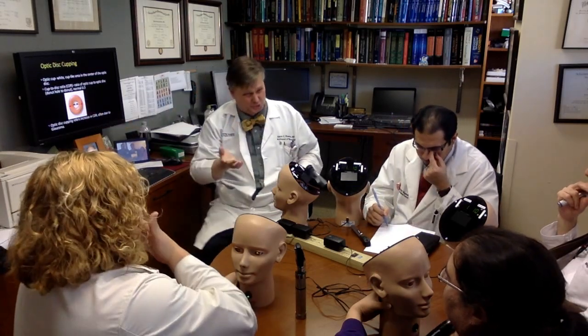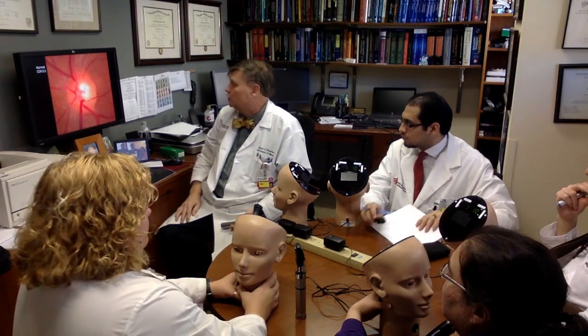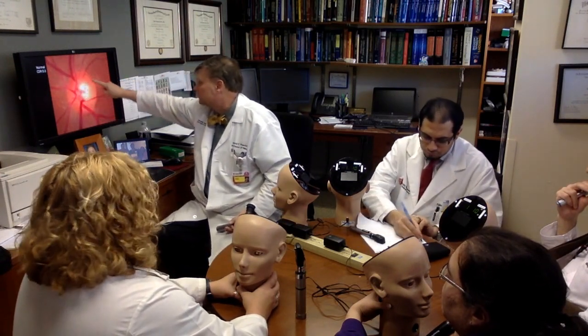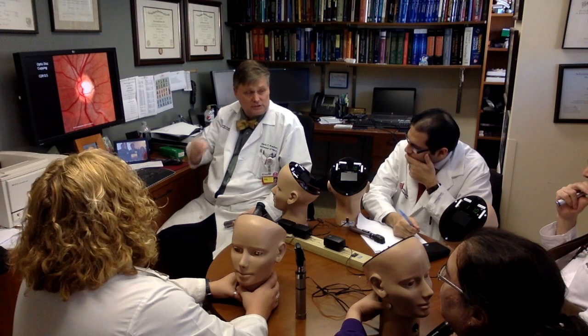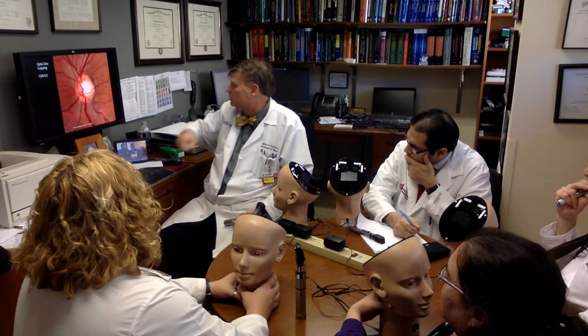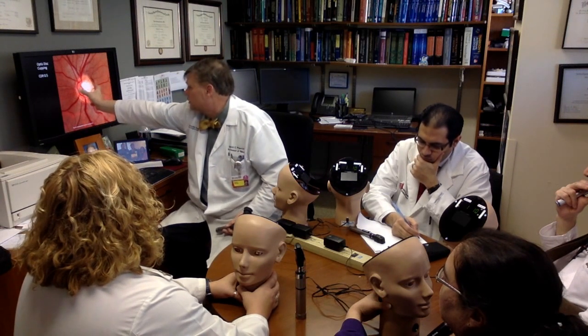Again, normal is like a third, maybe up to a half. If you look at a normal disc, so here's the disc, going around this size. Here's the cup. This is kind of a normal cup to disc ratio. However, if you look at this one, this is very similar to what you just saw in your simulator. You say, oh man, that cup is pretty prominent.